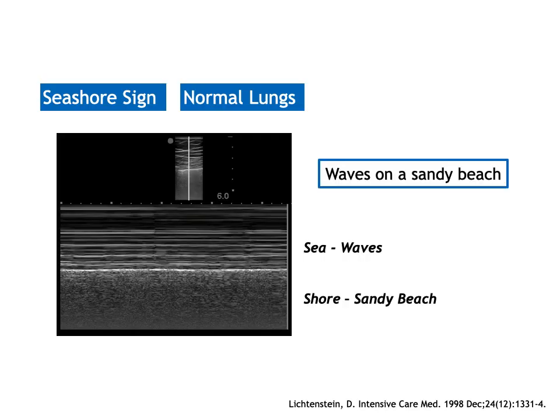And to confirm the presence of sliding, you can utilize the M mode, which is one of the basic ultrasound modes, in which you could assess the motion of one area of the lung against time. So here you have a very typical pattern which confirms the presence of sliding.